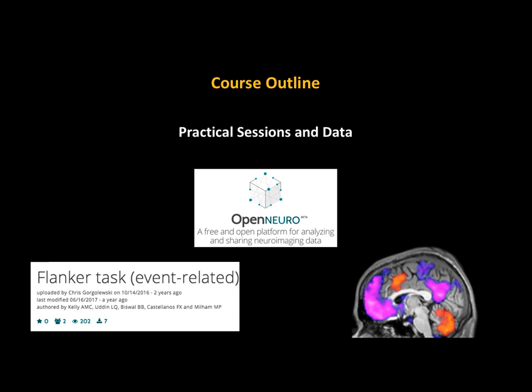So the reason I use this admittedly simple data set is because it'll allow us to cover all the concepts of fMRI analysis, pre-processing, building a model, and at the end of the day, we know what we should get. So it's very clear if we screwed up. Right? But even with this simple data set, there's a lot of stuff we can do in terms of ROI analysis, testing for double dissociations, doing a few different things.